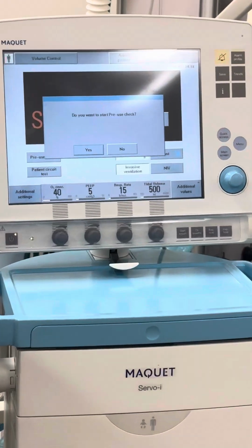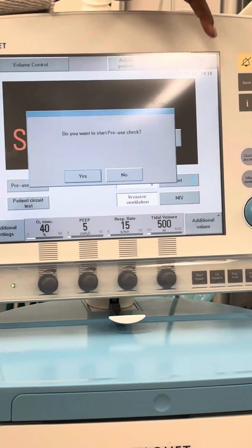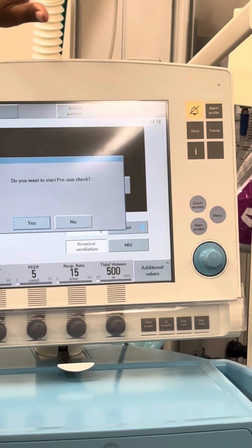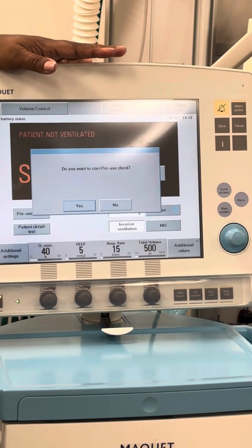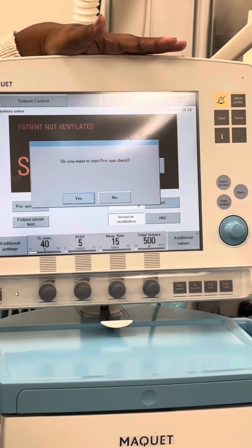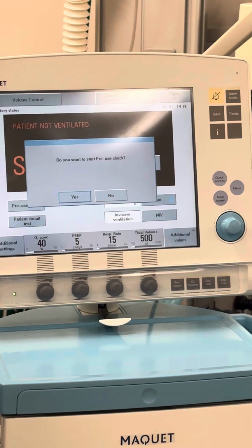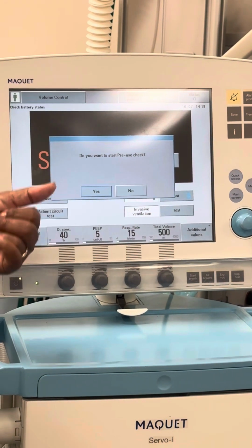All right, so it's going to ask you about that pre-check first. Alarm silent button in the yellow. All right, get used to it because this one I can't turn off the oxygen alarm. So every 2 minutes you're going to have to hit that silent button because I can't turn it off. I think it's in the machine in this one and it doesn't have it where you can turn it. But do you want to start pre-use check?